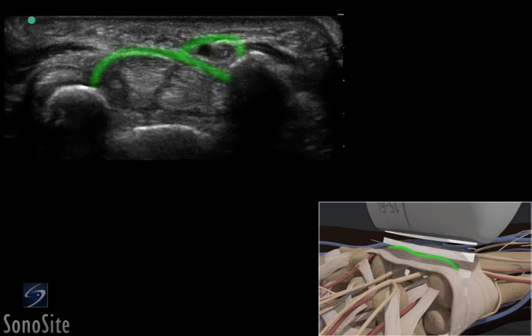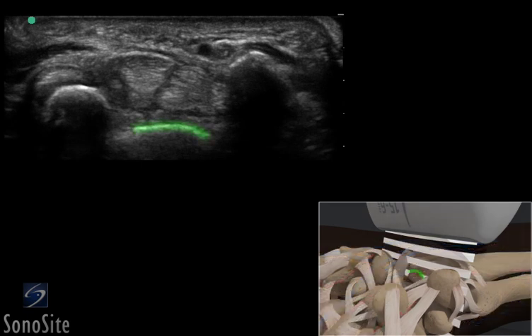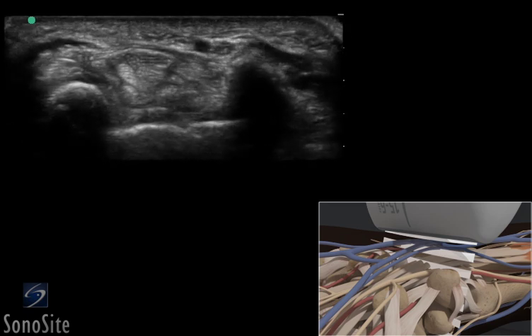The flexor retinaculum spans the wrist structures and is seen as a band-like structure. The bright, hyperechoic surface of the lunate forms the most posterior boundary of the volar wrist. The superficial and deep tendons of the wrist can be seen as light gray oval structures, which are highly subject to anisotropy.